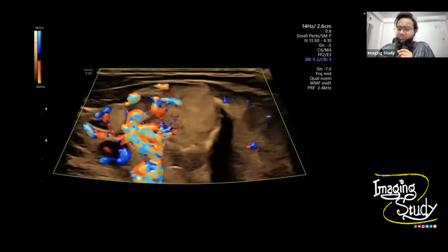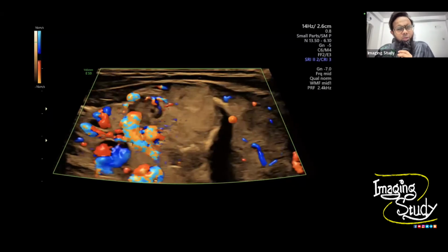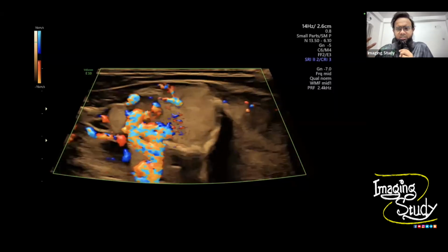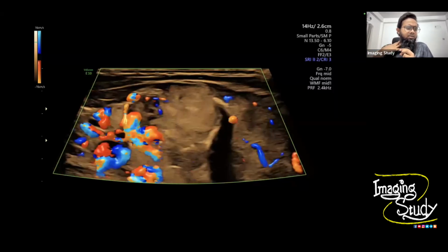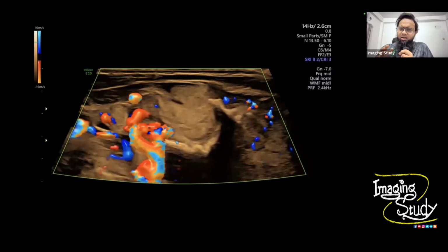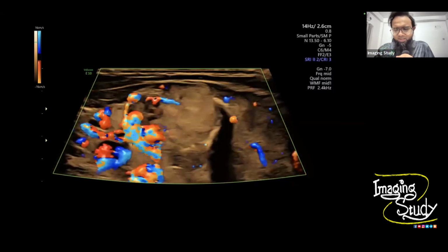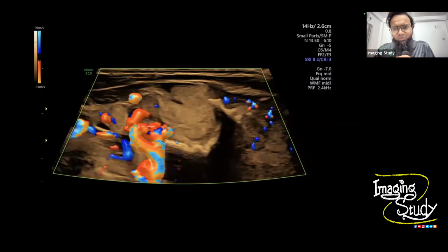Okay, so yeah, what about the left supraclavicular lymph node? Because that has got some different changes. If it was the papillary cell carcinoma metastasis, then it would show you cystic appearance, but it is quite different. So now let's look at the abdomen to make an answer of that question.